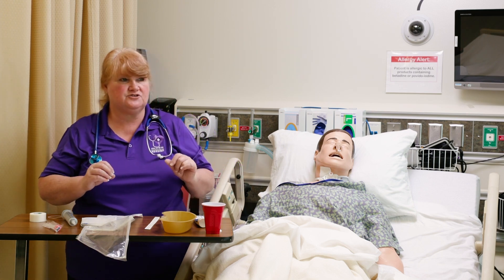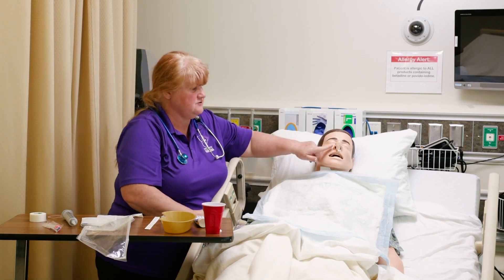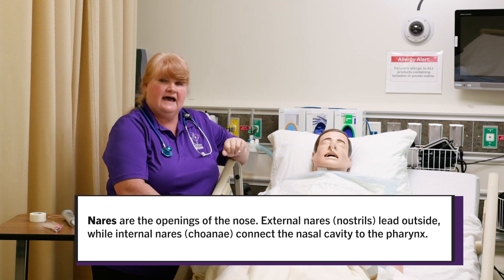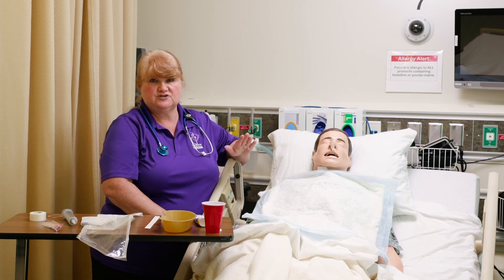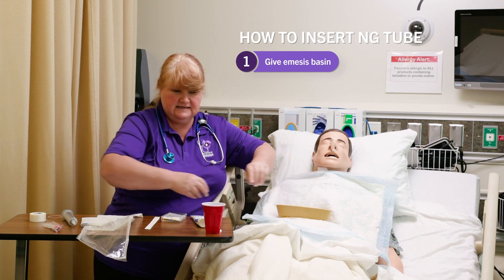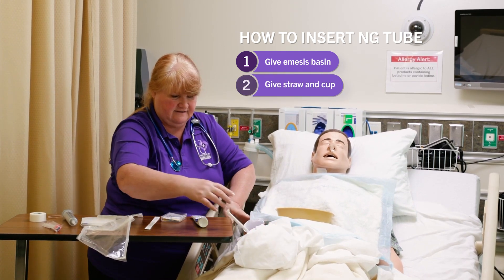You'll also want a blue chucks. Now we've got the blue chucks on the patient. We're going to check the nares for patency — ask the patient which one they can breathe best out of — and ask your patient to raise their hand if they have any signs of distress. We're going to give them the emesis basin, and the cup and straw in their hand.